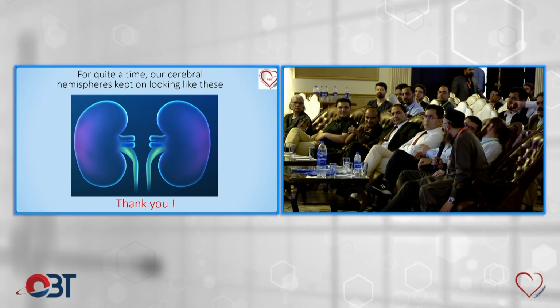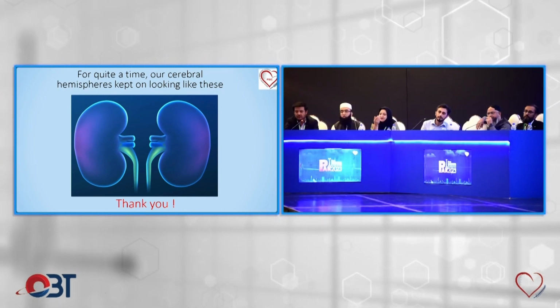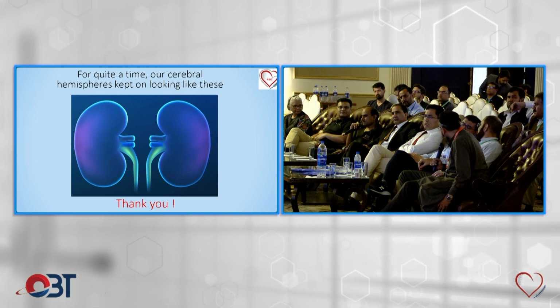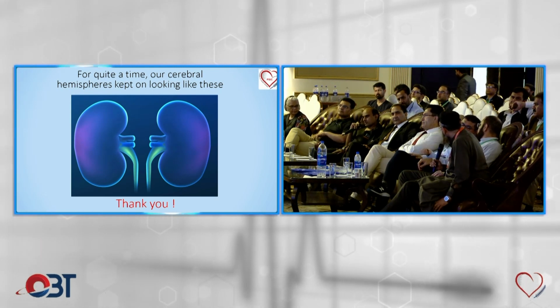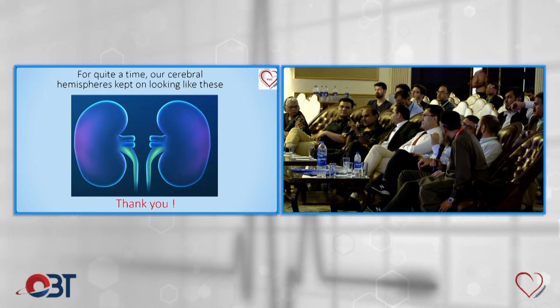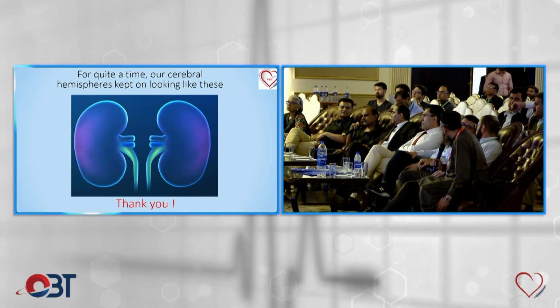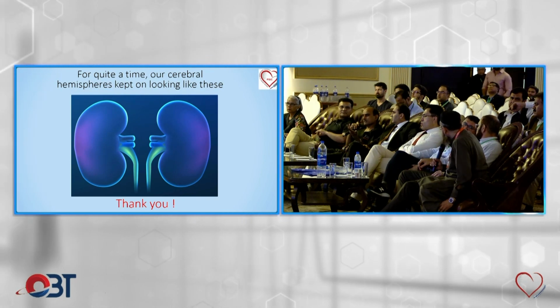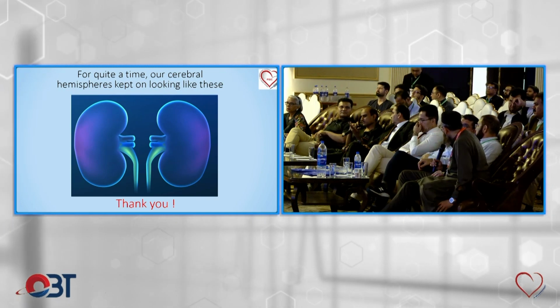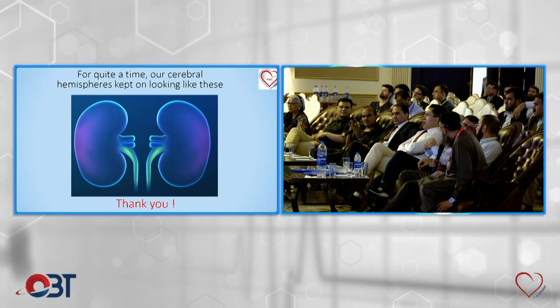No doubt about it. Yes. The only thing is, could you have used IVUS to place the diagonal stent at the ostium? Just at the ostium? Yeah. Yesterday one case was shown of ostial PCI. So I would admit that this idea did not cross my mind at that time. Yeah. So I saw one case in the same hall B, in which ostial circumflex stenting was done. It was an isolated ostial circ lesion, and they kept one wire and IVUS near the distal left main, and they visualized by the IVUS the ostium of that circ, and they placed the stent, and it was excellent.